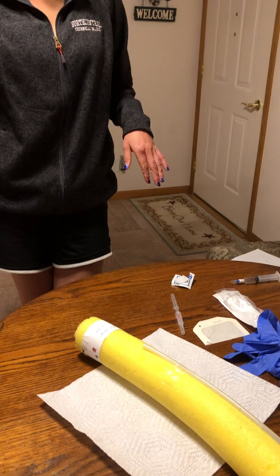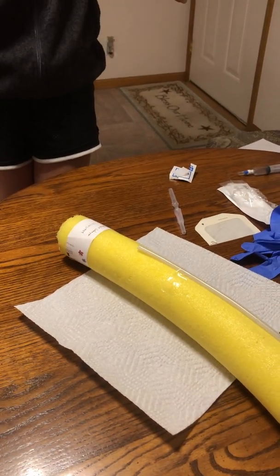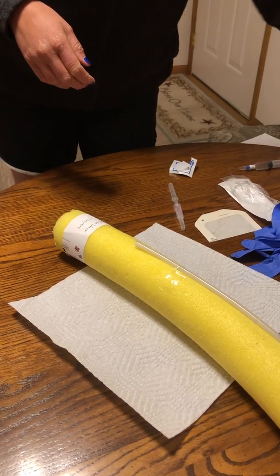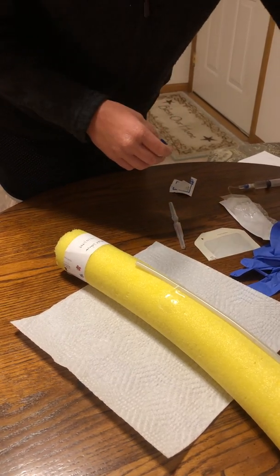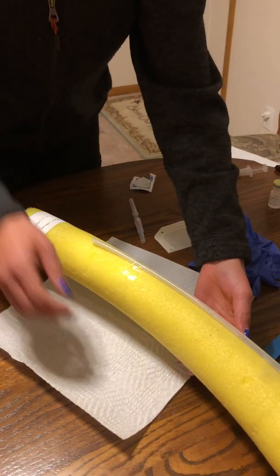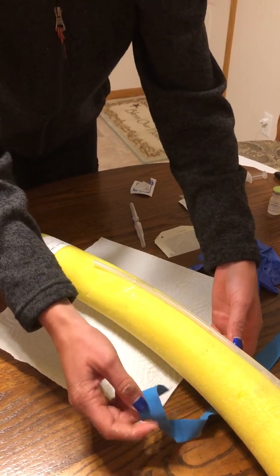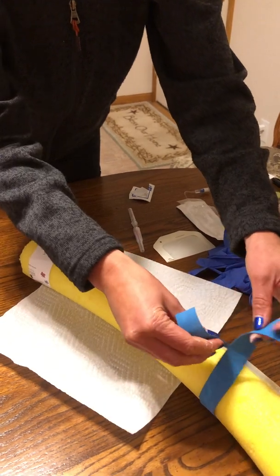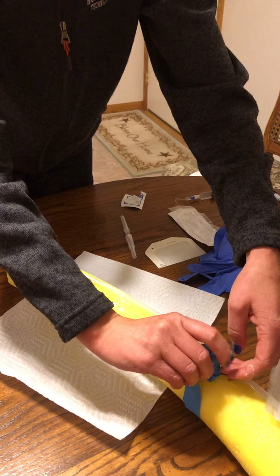And next, I'm going to do the site. So with the tourniquet, you want it to be quick release.